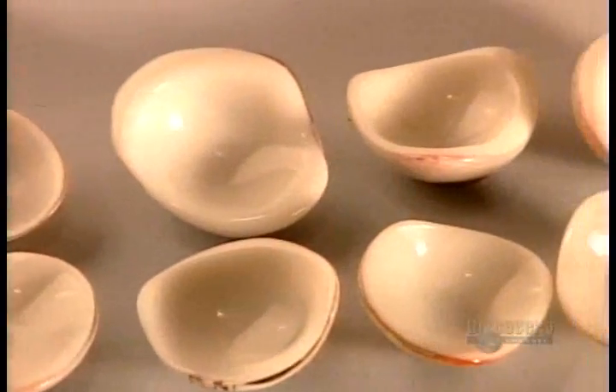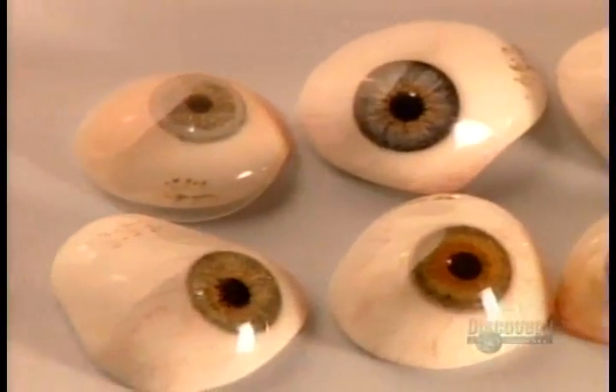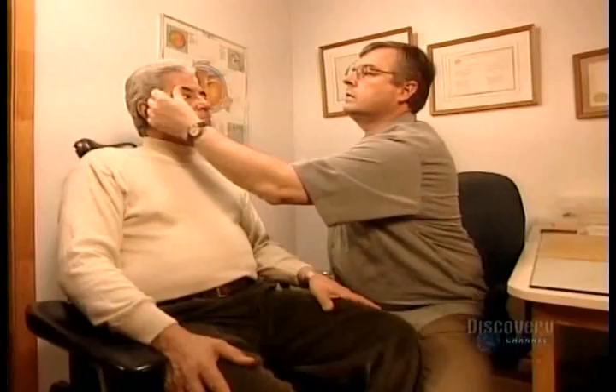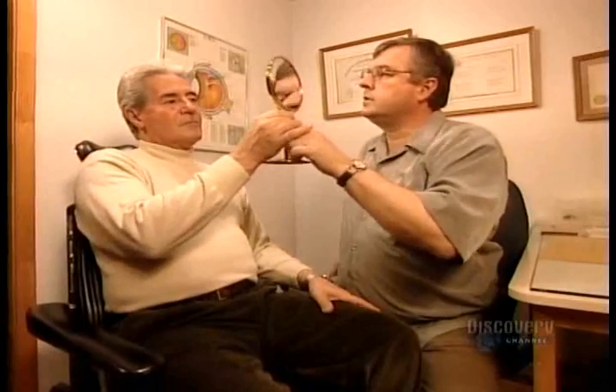The shapes and colours of artificial eyes are endless, because patients' eye sockets and irises greatly vary, as do their scleras — the white of the eye. This artificial eye, or ocular prosthesis, is ready. The final step is to ensure that the fit is perfect. The patient's ocular muscles attach to the implant, enabling his artificial eye to move in unison with his real eye.